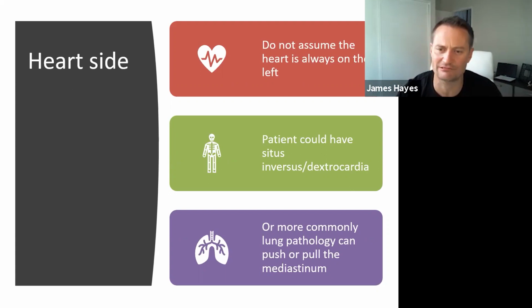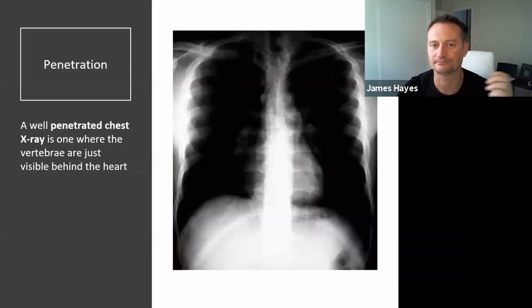So they've got a left-sided pneumothorax. You go to put in your chest drain, lo and behold, you've actually punctured their only good lung, and they now have 2 deflated lungs. That's getting quite serious. All right, so always check, find the person who did it, and tell them to, if necessary, do another one. A chest x-ray has no radiation. Well, no, obviously it has some radiation, otherwise it wouldn't be called an x-ray, but compared to the type of background radiation you're getting every day, it's virtually nil.